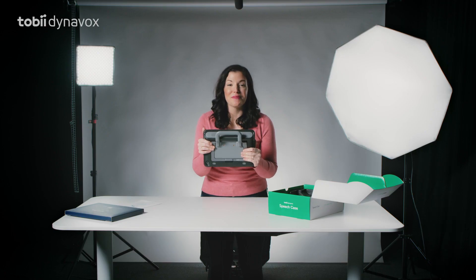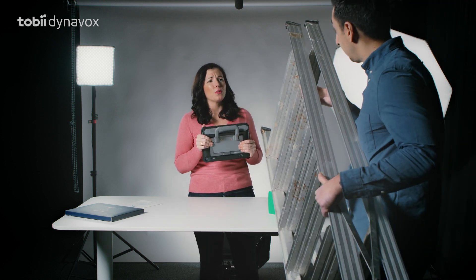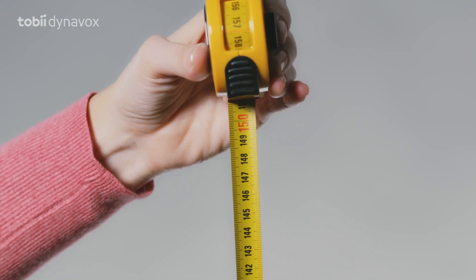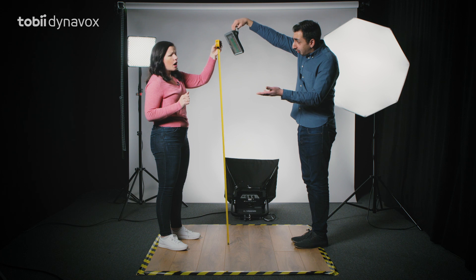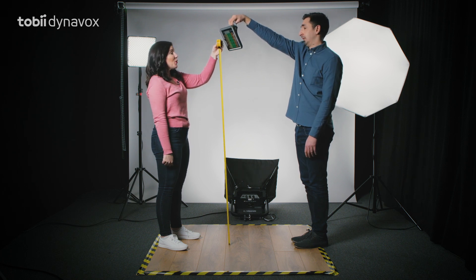And now it's time for the drop test. Oh Tarek, I'm sorry, we're only dropping it from 1.5 meters. Okay Tarek, on the count of three. One, two... Wait! Is it on three or after three? Like on four? Just on three. One, two, three.